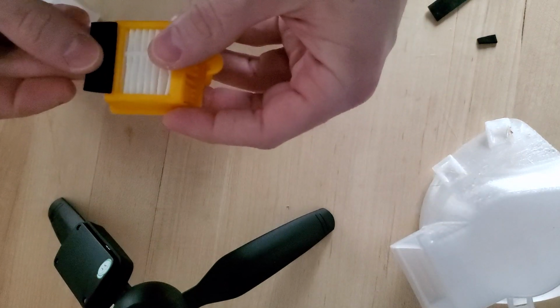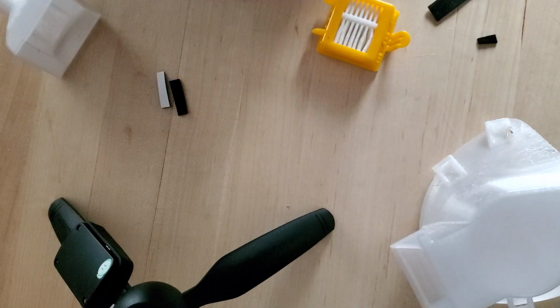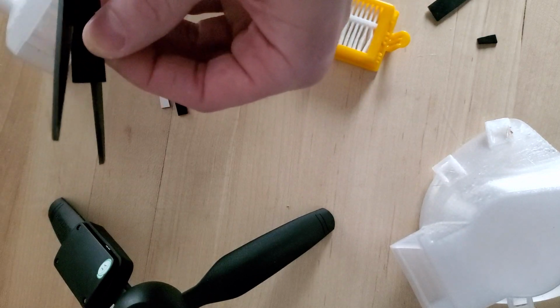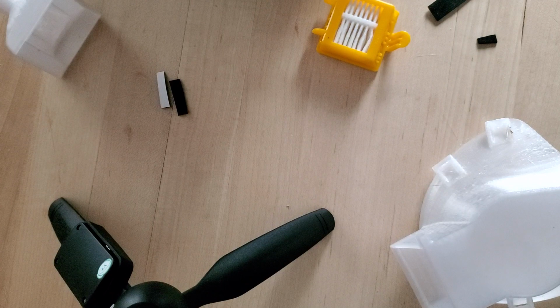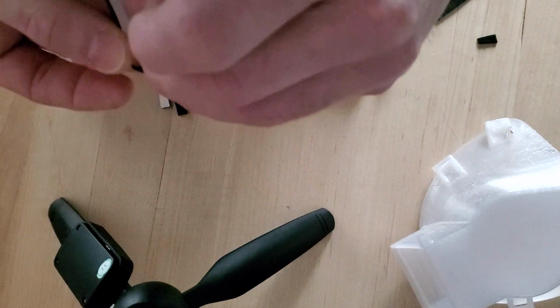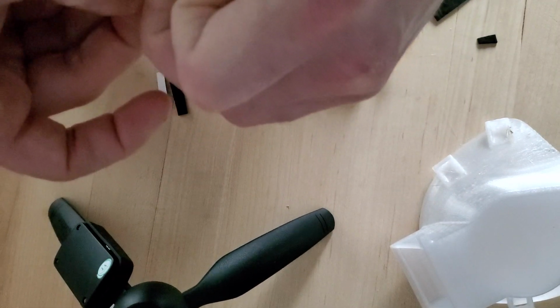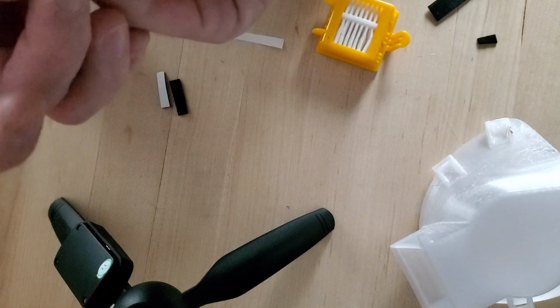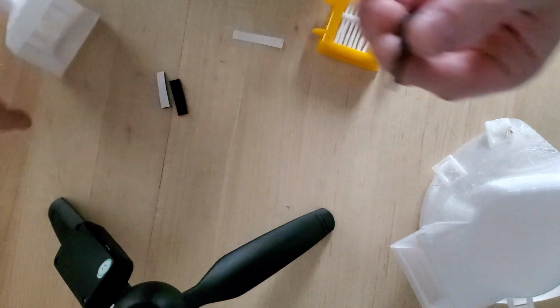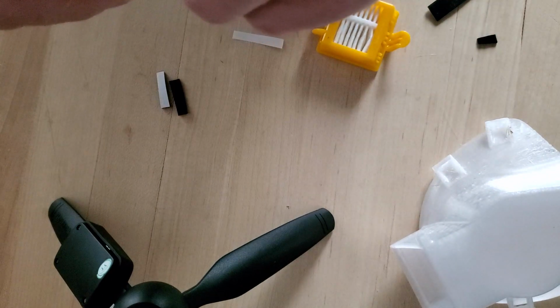This piece right here, maybe could go a little longer, but I think that'll be fine. It tends to stretch when you place it. And remember, the outside edge is actually the straight edge. You can try to cut a straight line, that's great, but the outside edge is always straight. So if you just try to plan to use that, that can be a little tricky.